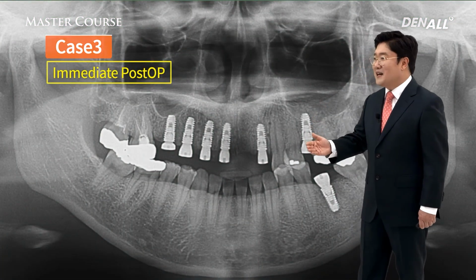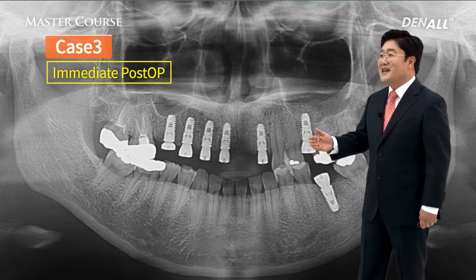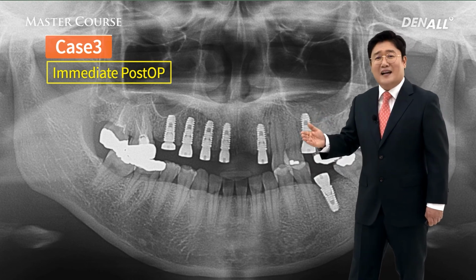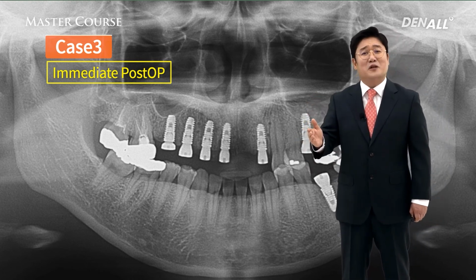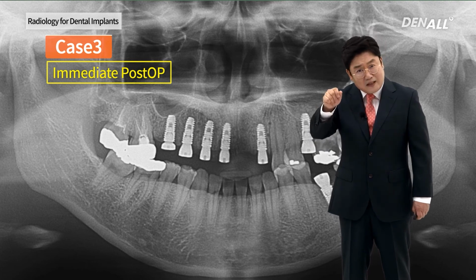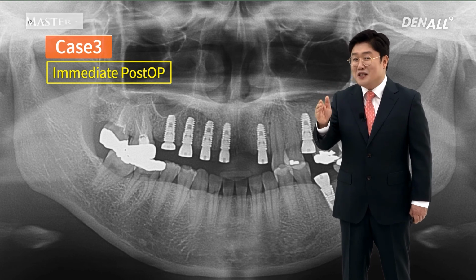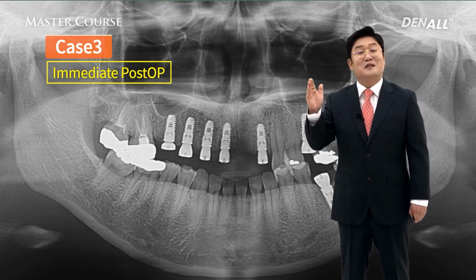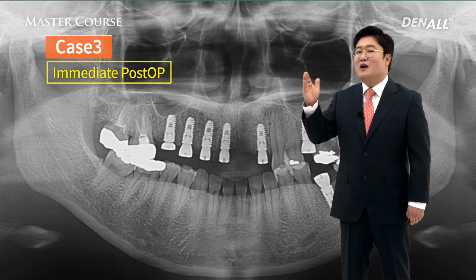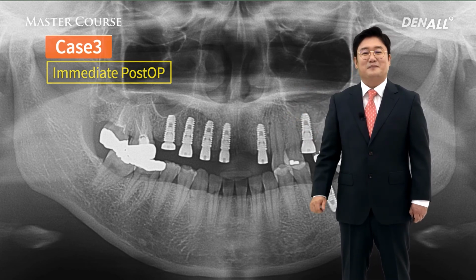In the past, when we did not have digital or CBCT, this was the most advanced technique. After surgery on the panorama, you can see implants were placed very accurately. In the past, panorama radiology, X-ray template or radiologic template, guide or stent, whatever the name is, after removing the metal rods, a surgical template, surgical guide, or surgical stent was used like this. Absolutely necessary to use it. So I wanted to show you this.